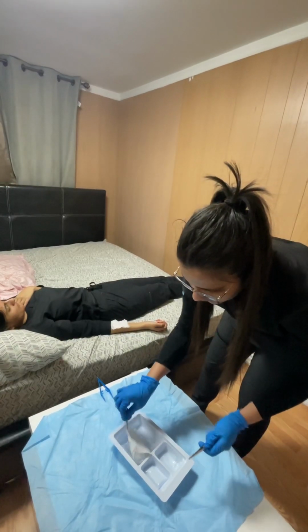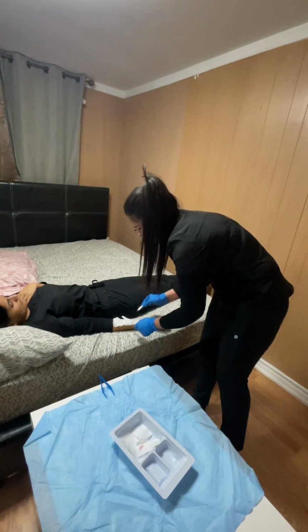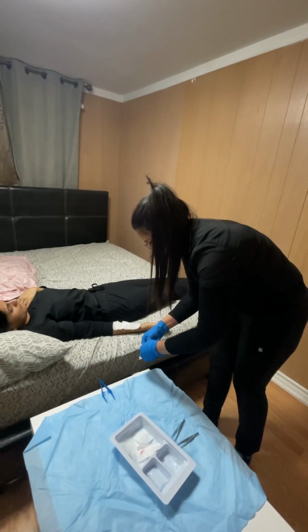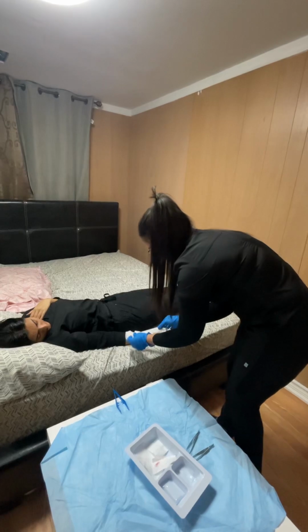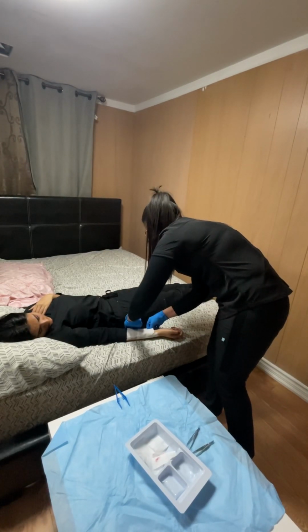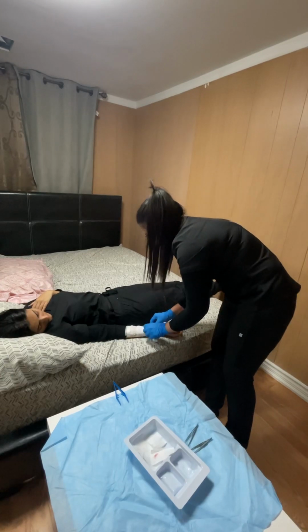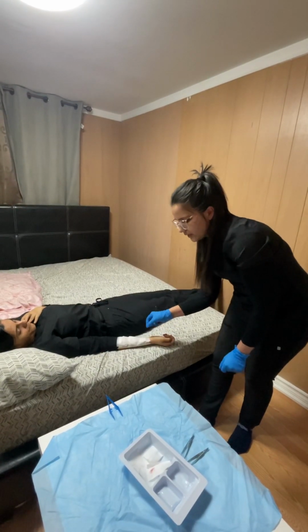Since there is no bleeding, we could add the pads, but there's no need for that. I'm adding another gauze piece over it. With the help of taping, I'm going to secure the new dressing by taping along the borders. On this tape, I am writing down my initials as I have performed this wound dressing procedure, and I'll write out today's date and the time when the procedure is performed.